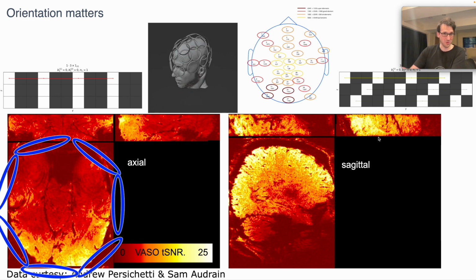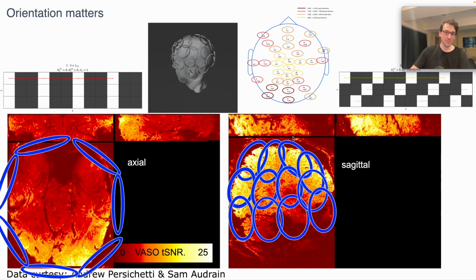In the sagittal view, however, this is different, because the individual elements in the 32-channel Nova coil, for example, are aligned in a star-like fashion. This means that when you have a sagittal protocol covering the same areas, you have two spatial dimensions, namely the spoke direction as well as across the different spokes, right? So you have an additional degree of freedom to do GRAPPA and shift your aliases around, which lowers your g-factor penalty. This, however, is not generally true for all brain areas.